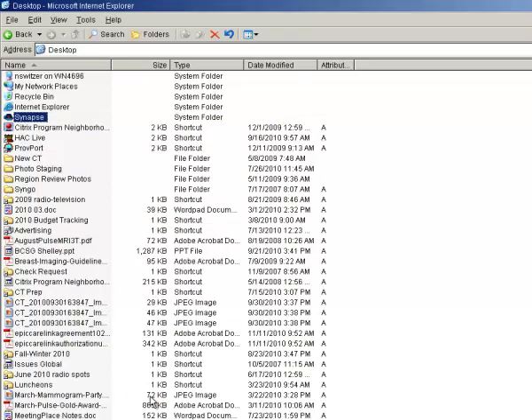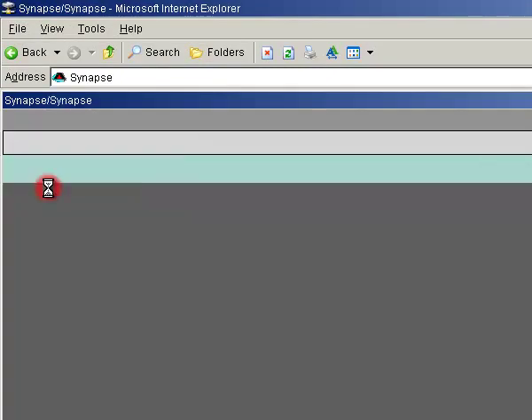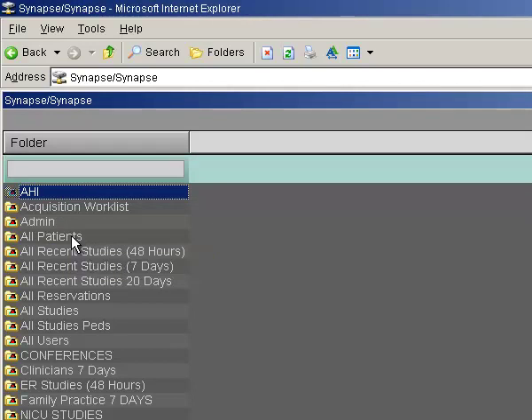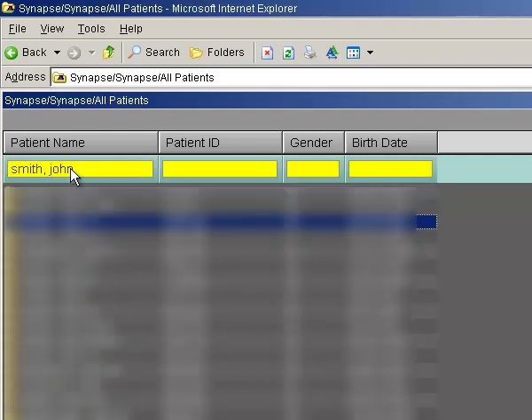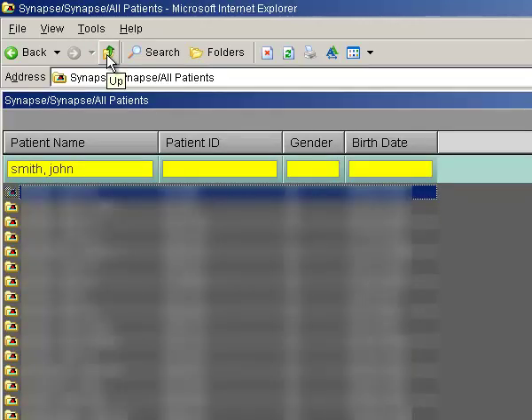To get back to the Synapse program, double click the Synapse program name. Now double click the word Synapse that appears on the next screen and you'll be back to your folder list. Let's check to see that our changes have taken effect. I'll double click the All Patients folder once again and type Smith comma John and hit enter. Next I'll double click the correct John Smith to open up his record of exams. Satisfied with what I've seen, I click my up folder button to get back to the All Patients folder. And voila — Synapse has remembered my search terms.